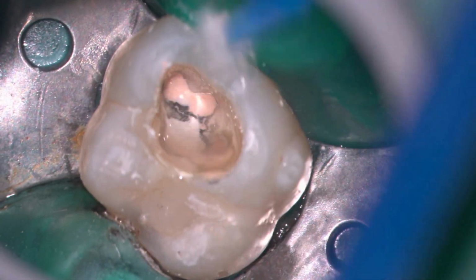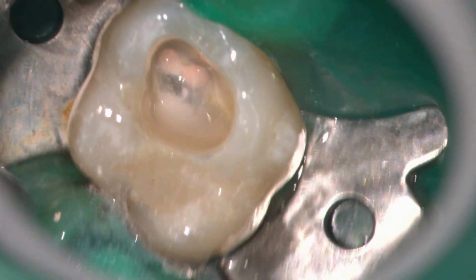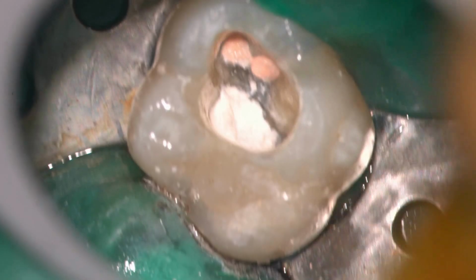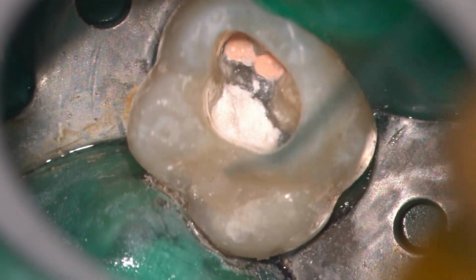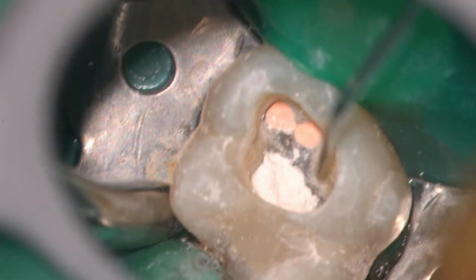At this point, I'll go ahead and add more chloroform to the pulp chamber space, clear the gutta percha, clear excess Cavit off the walls, then add some more alcohol, and then I'll do some sandblasting after rinsing this clear to really micro etch the surfaces of dentin in preparation for the etch, bond, and placement of the resin material.